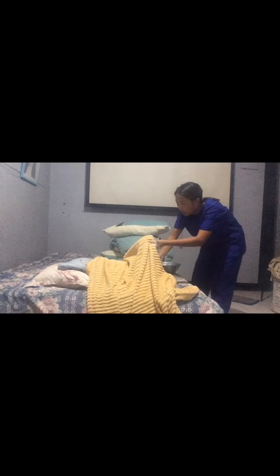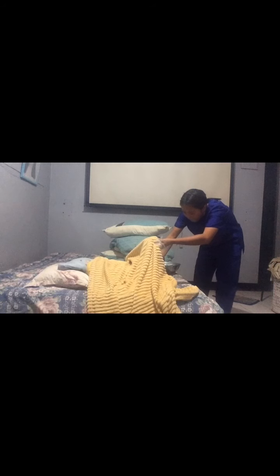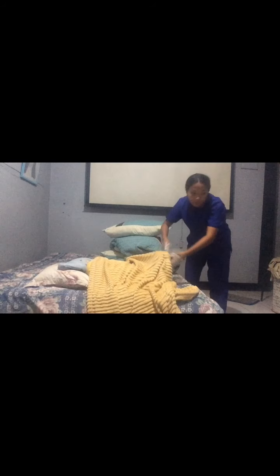Ask the client to begin voiding. When the stream of urine begins, put in the specimen container and obtain 30 ml of urine for routine analysis or 5 to 10 ml for culture and sensitivity, or C&S. Remove the container before the client stops voiding. Allow the client to complete voiding, then wash the perineal area.